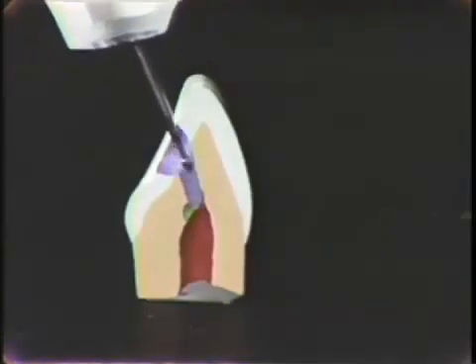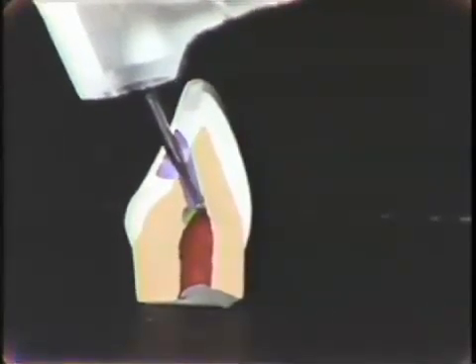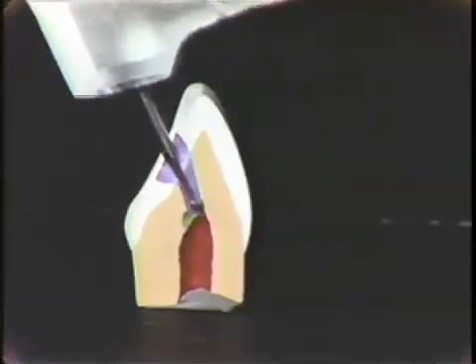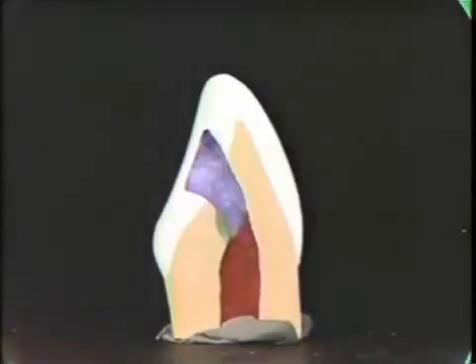Now you keep on doing this in and out, feeling for the roof, making sure that you keep away from the walls so you don't gouge the tooth, until you feel the burr pass from the pulp chamber to the surface without any kind of bump or click. When you feel this, you turn the handpiece off, you get your endodontic explorer, and feel the walls of your cavity preparation. Make sure that you've completely removed the roof of the pulp chamber and that you haven't gouged the walls. We've completely removed the roof.